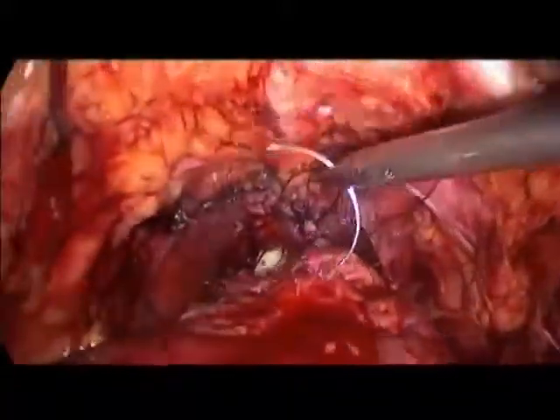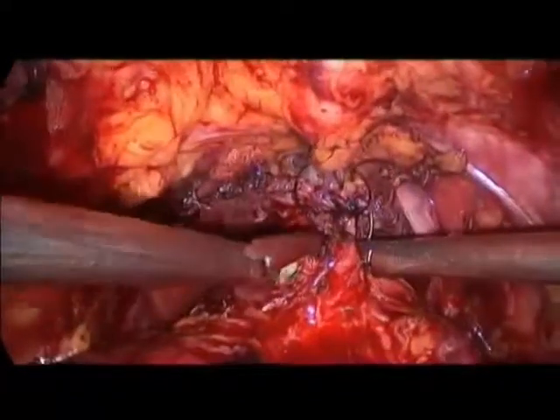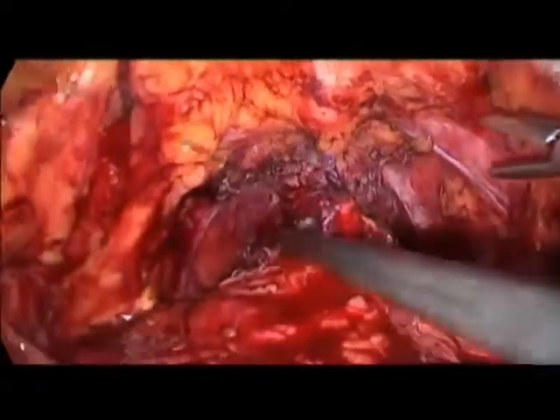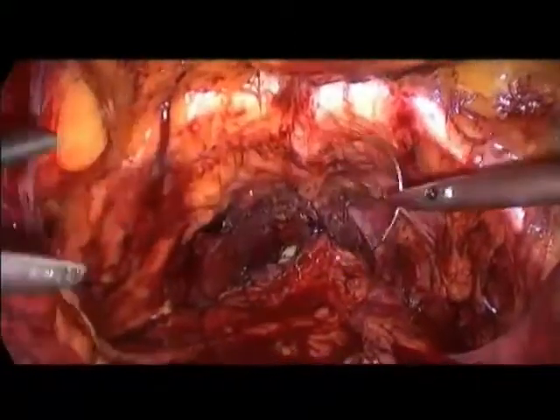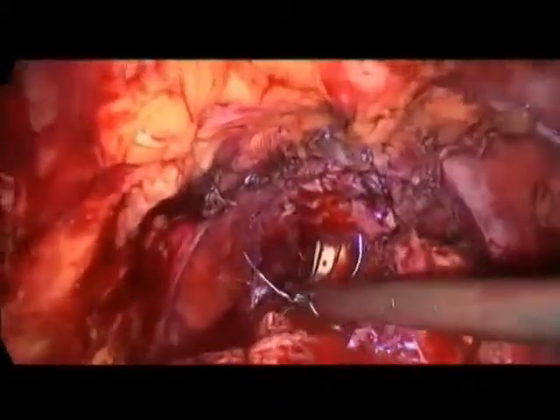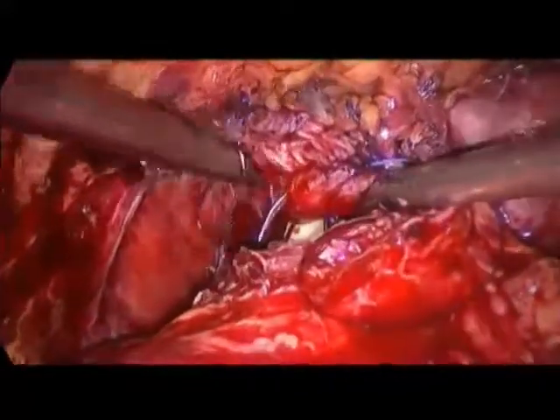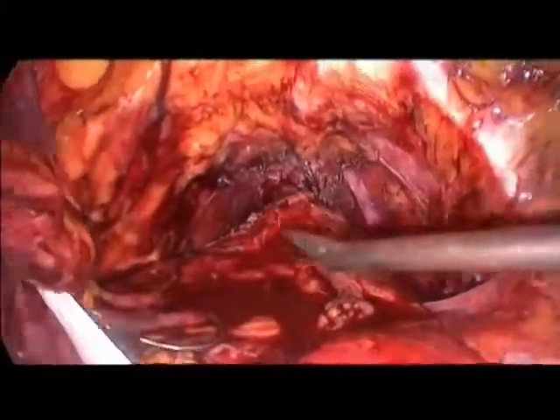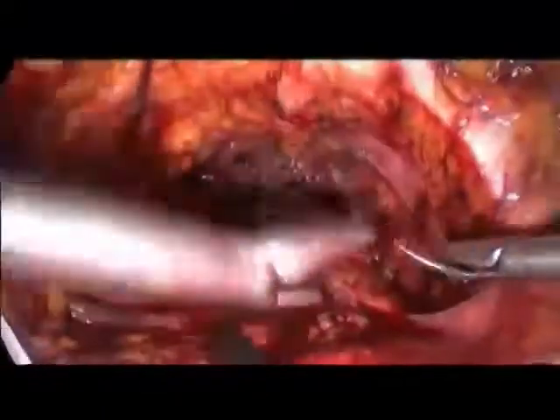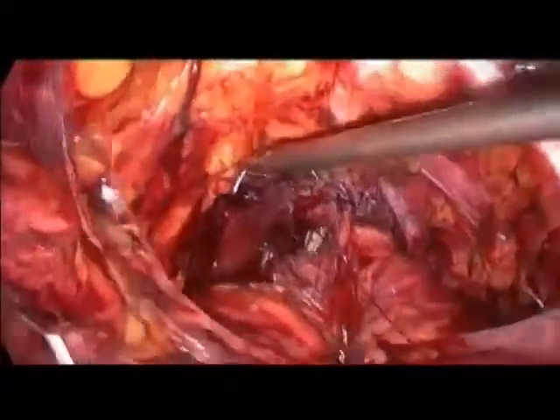And you see here that I'm completing the hemi-running circle on the right side. I'm already at 10 o'clock. On the left. Exactly, this is what I meant, exactly. And I made a second U stitch between 9 and 10 o'clock in order to achieve the suture with one thread on each side of the anastomosis. And we will see after that if we need an additional stitch or not. This is 12 o'clock, right side. And probably I need an additional stitch made forehand, right hand, on the final left side here at 11.